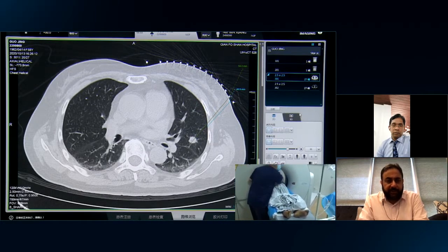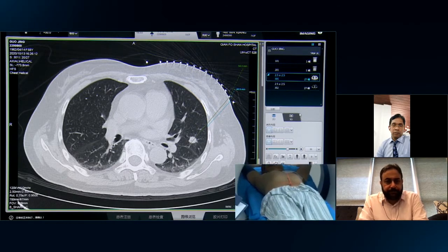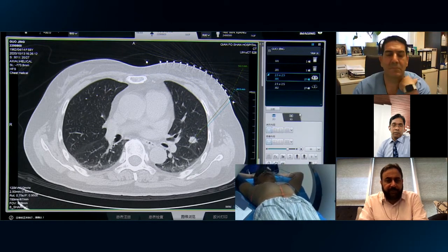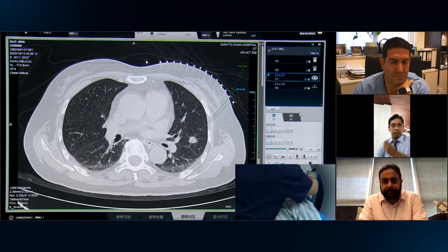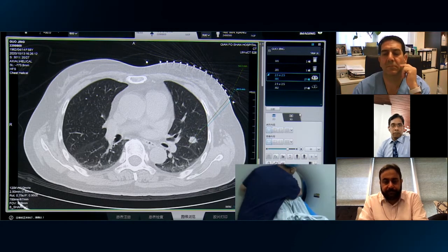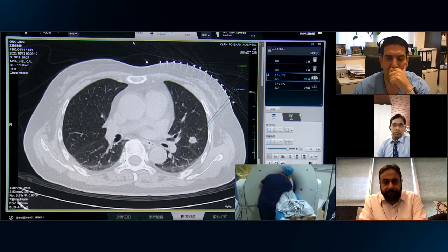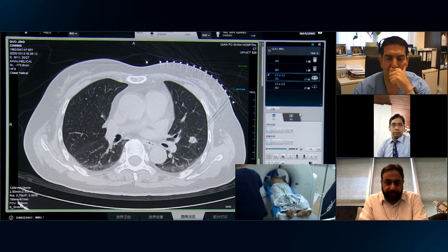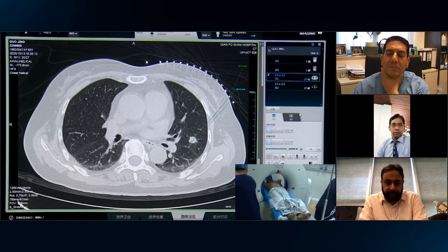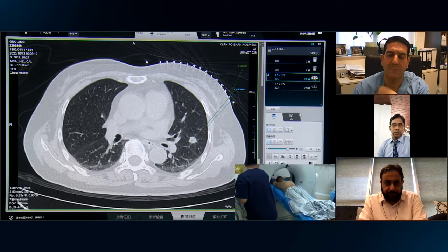Has this lesion been biopsied before? Oh, no biopsy, because it's PET positive. It's very typical in the CT scan. It's just a metastatic lesion, and she has a colon cancer history, and the lesion has gradually enlarged in the last few months.